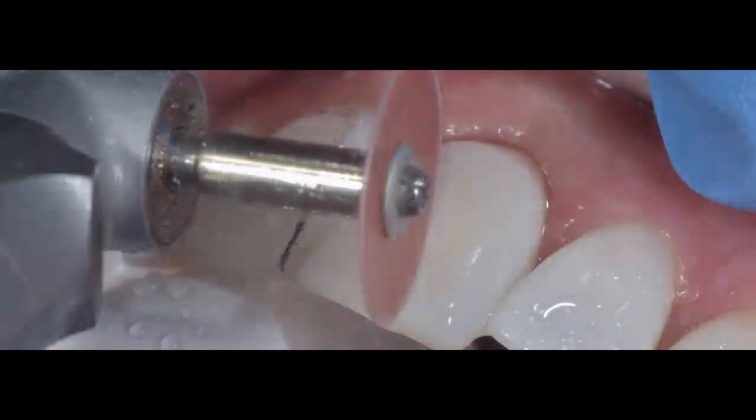Once we're done with our restorations, again, we always end up with a little bit more than what we need. We remove the rubber dam and we start our finishing process. I can't recommend any other finishing system more than Soflex. This is the one that I like and I love and I use. I've used other systems, and there are other systems out there. Actually, Kerr makes one that is also very nice. But honestly, I just haven't found one that I like more than the Soflex system.